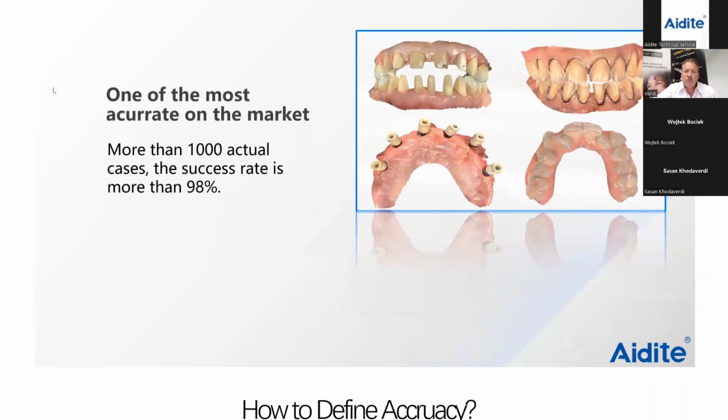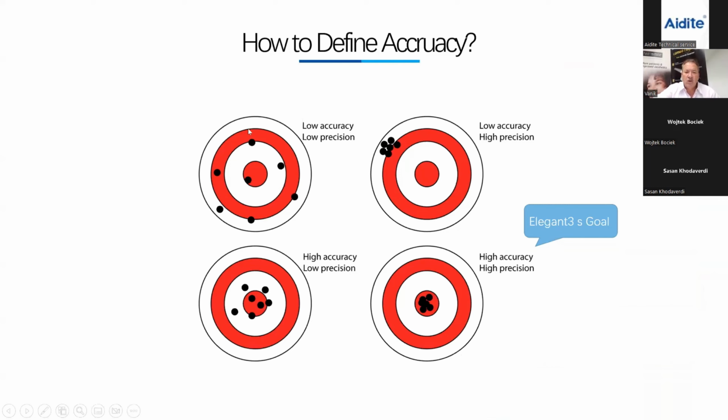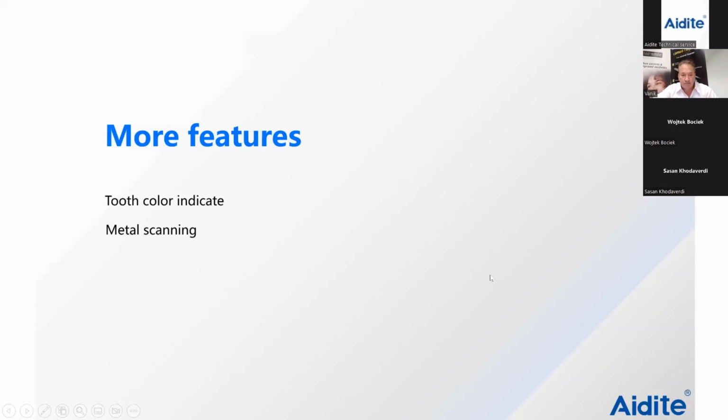How do we define accuracy? When you shoot on a target, low accuracy is when you hit the target but you have bullets everywhere, okay? Low accuracy but high precision is when you shoot on that target and all your bullets are in the same area. So it's very precise, but it's not so accurate, okay? And we want high accuracy and high precision, so we hit the target. What we mean with that is on a repeatable basis, that when we scan, we can always scan on a repeating basis.